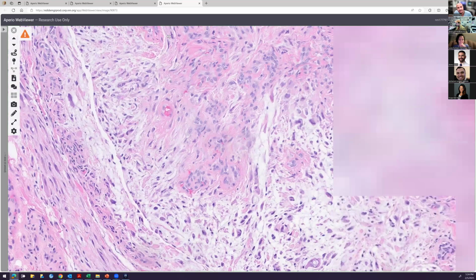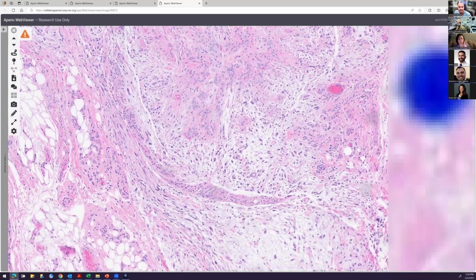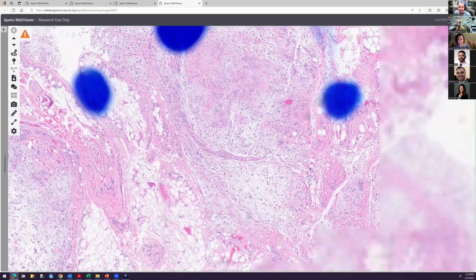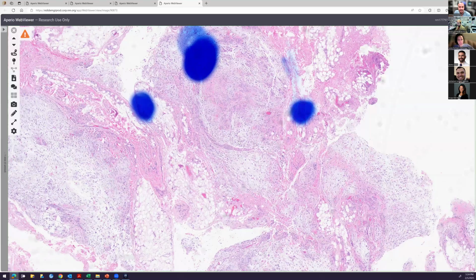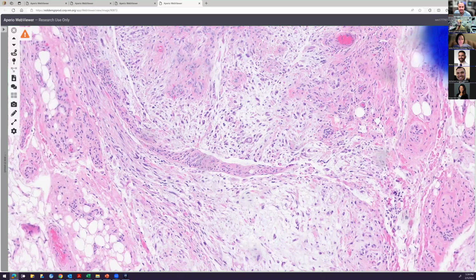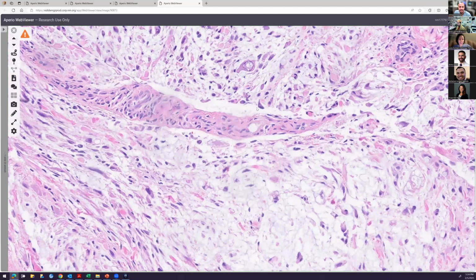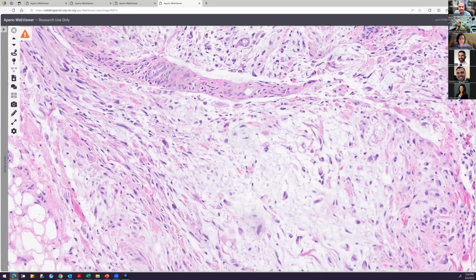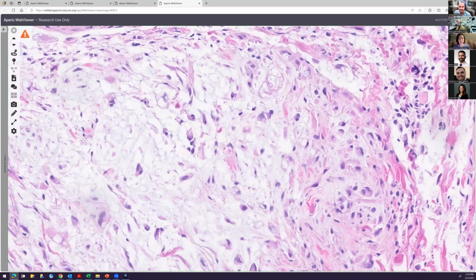probably if I can find another example around here. Sometimes there are fewer and far between. But anyways, another example of these. The cells look like they had mucin vacuoles in their cytoplasm. Is that true, or am I just picking? So within MIFS and myxofibrosarcomas, you'll occasionally see pseudolipoblasts. Oh, okay. It's because they're filled with mucin, right? Right. So that's what these cells are. It's like a pseudolipoblast. So that's fairly common. All right, so that's an example of the MIFS.